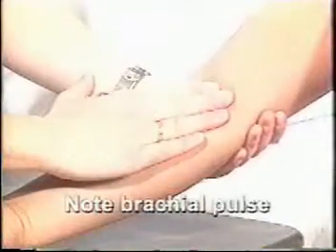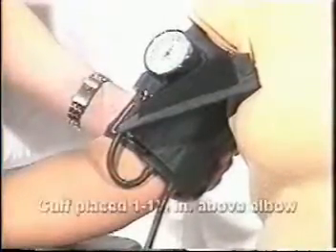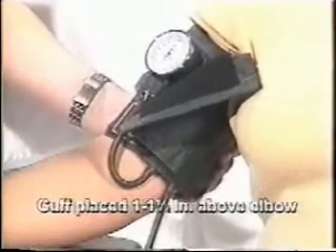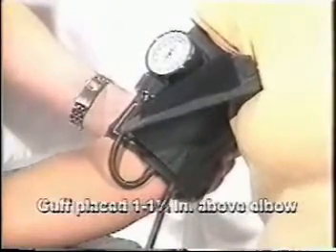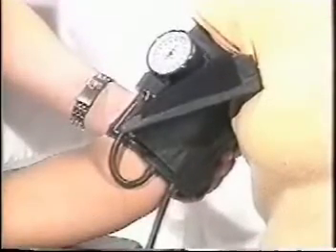For placement of the cuff, the first thing you need to do is to locate the brachial artery at the elbow and note the pulse. And then place the cuff snugly and smoothly around the arm, about 1 to 1.5 inches above the elbow, with the arrows on the cuff pointing toward the brachial artery. If the cuff slides down the arm, it's been placed on too loosely and will give an inaccurate reading, so it needs to be put on again a little bit more snugly.